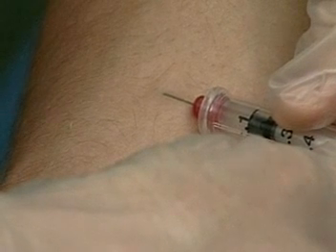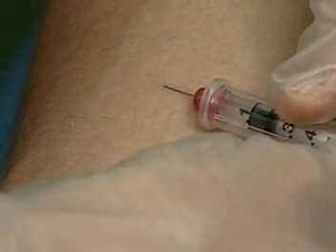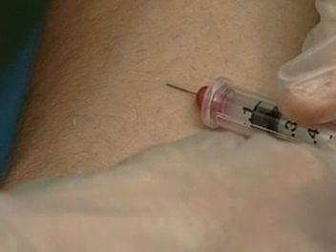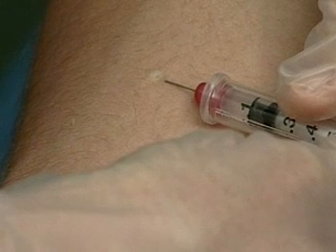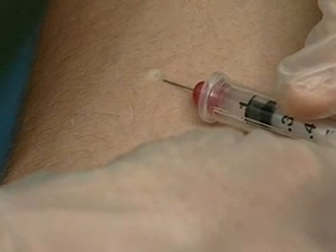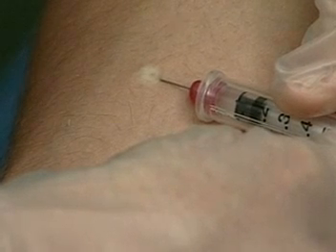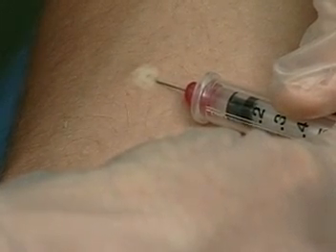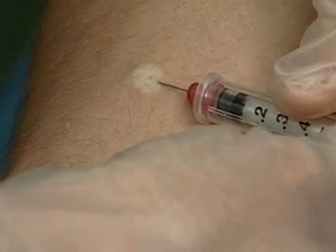Stabilize the syringe. Do not aspirate. It is not necessary because the dermis is relatively avascular. Inject slowly. Resistance may be felt because the dermal layer is tight and does not expand easily. Watch for a wheal to appear on the surface of the skin. This indicates that the correct injection technique was used.